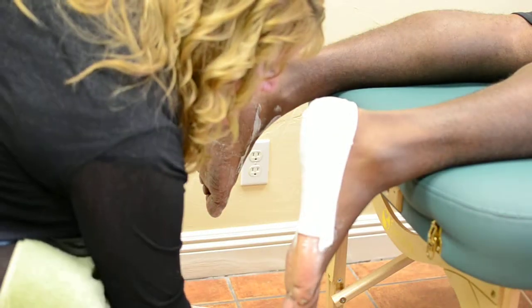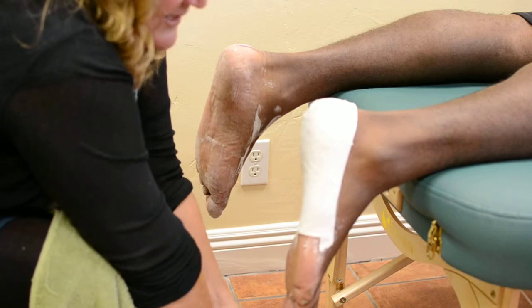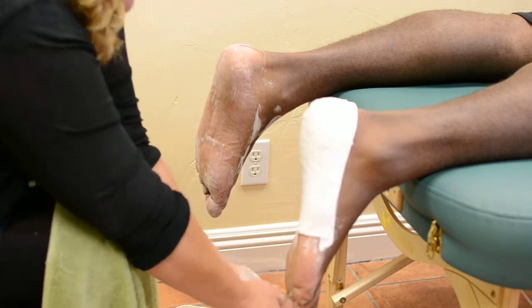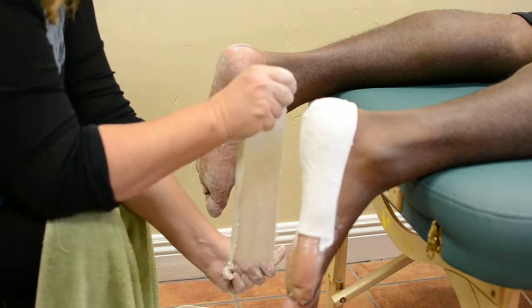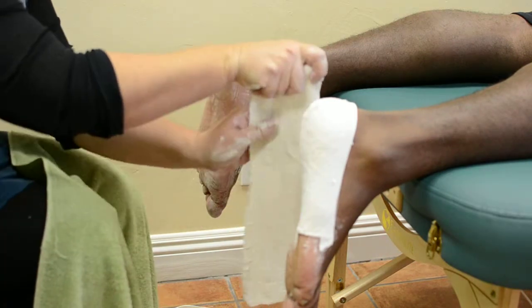Wow, so that dries pretty fast. Yeah. And you just kind of smooth out all the air bubbles. And while it's drying, I try to make sure that I'm getting a good contact in the arch, and that none of the plaster is popping.